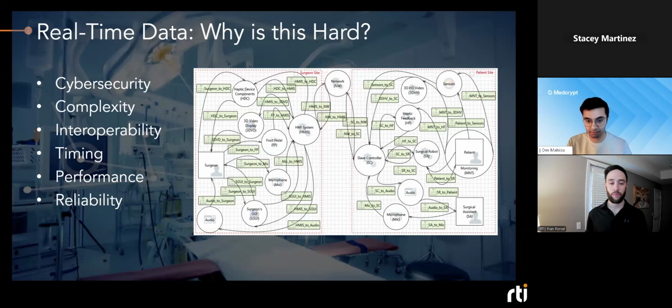And then when we add on things like, hey, in addition to meeting all those requirements, you need to also make sure you're doing cybersecurity, like not transmitting your data in plain text, and having unique keys at each endpoint, it really makes the problem difficult to solve, right? Especially when, on the R&D team, your main goal is to get the clinical functionality working. You really want to help patients, and make sure your device has that clinical functionality so you can take it to market. And so all these requirements can be really overbearing and complex for engineers to solve for all at once.